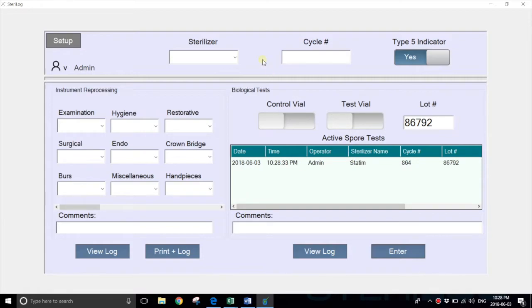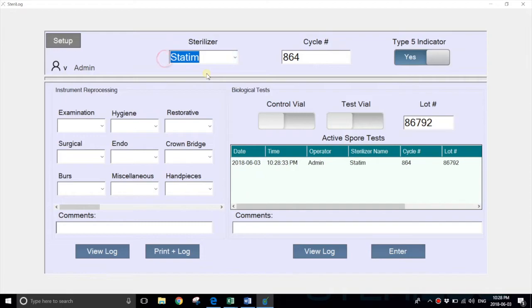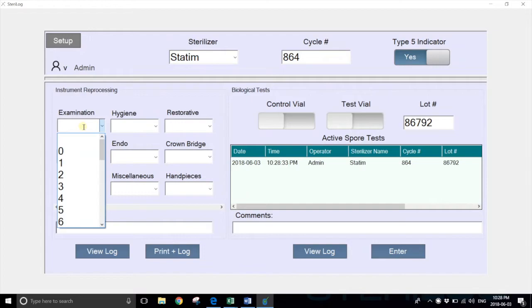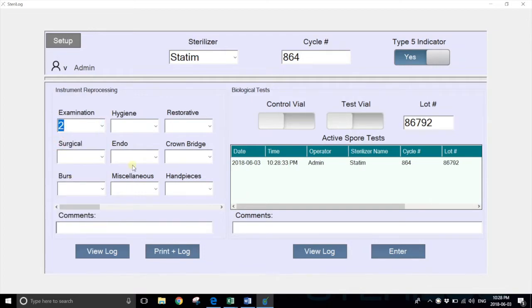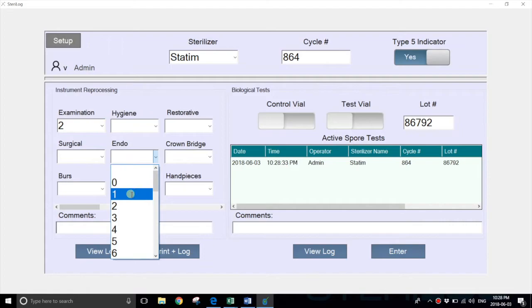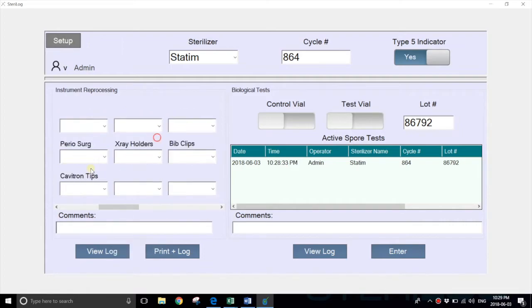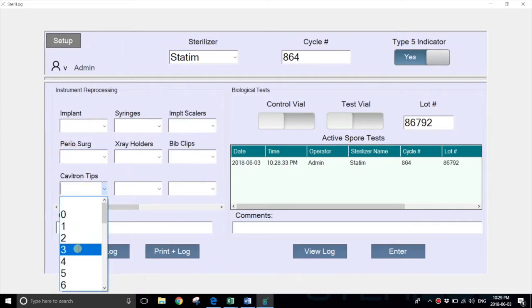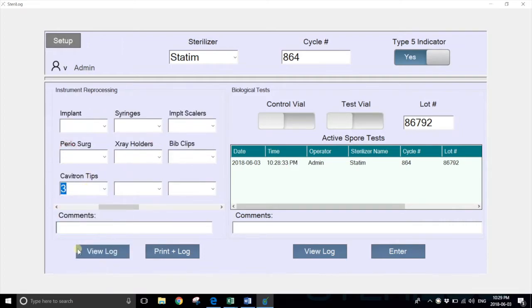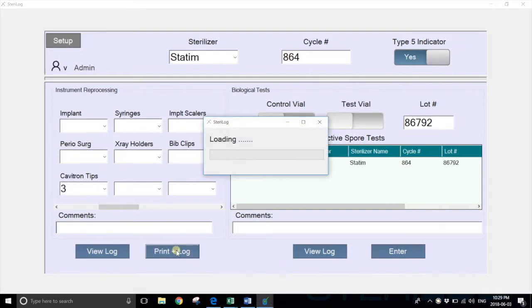They would then select their sterilizer again with the same cycle number and start by selecting their instrument kits. For example, if we wanted to load two exam kits, a couple endo kits, and perhaps three Cavitron tips, you select them and hit print and log.